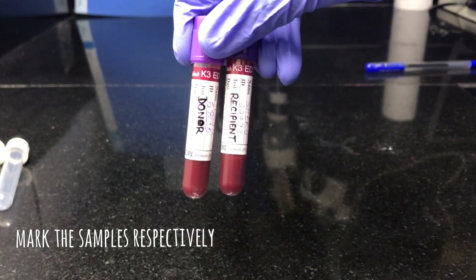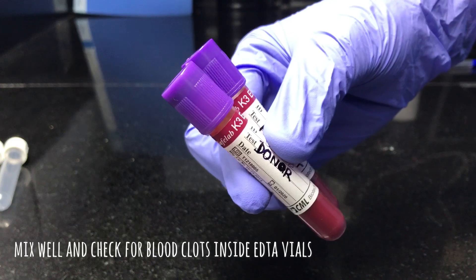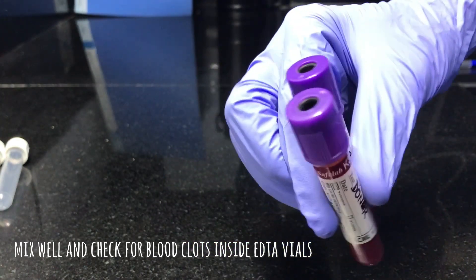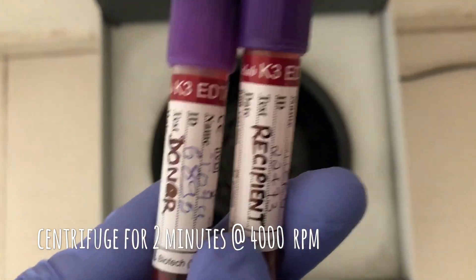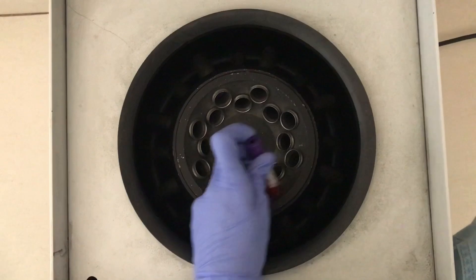Collect the samples and mark them respectively. Invert the test tube several times to check for clots. After checking, they are good to go for centrifugation. If the sample is submitted in serum separation tubes, then you need to centrifuge it for 4 minutes.